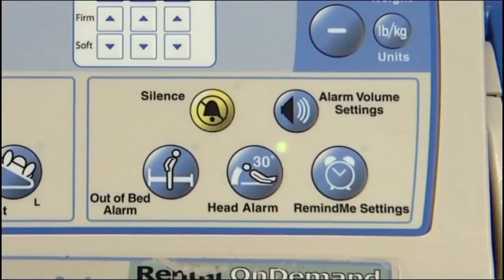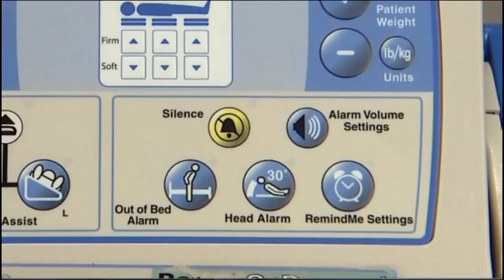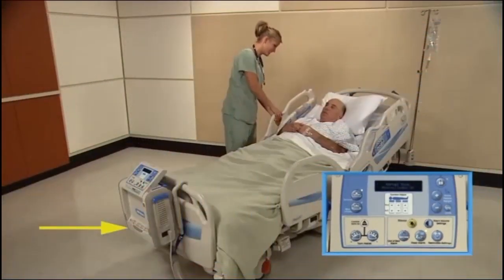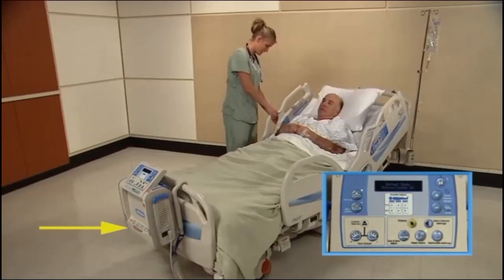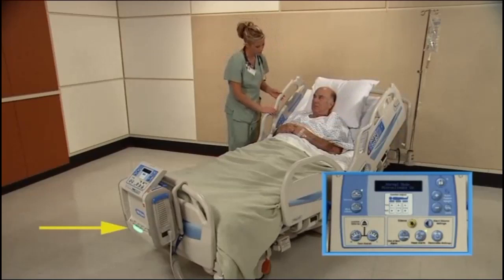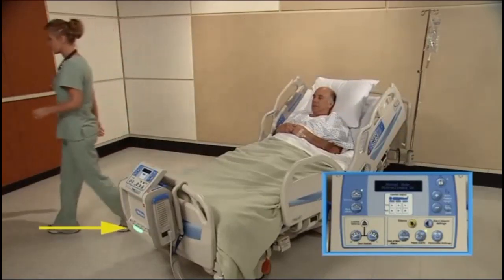The middle button is the 30-degree head-of-bed elevation button. The light bar will flash orange to indicate if the head of bed has been lowered below the 30-degree mark when this feature is activated. An audible alarm will sound after 5 minutes.